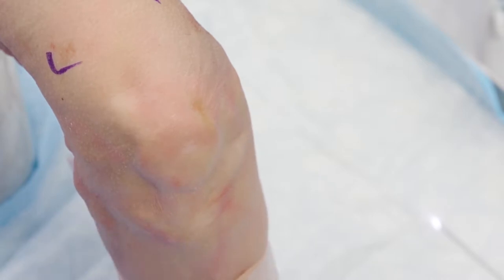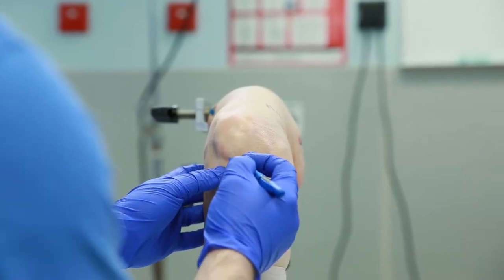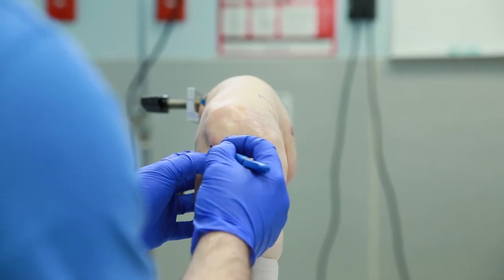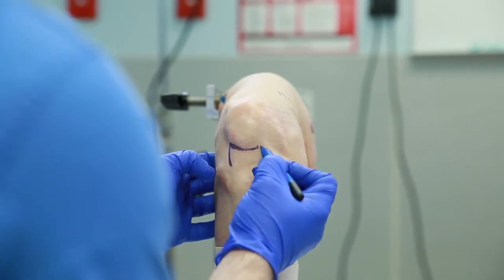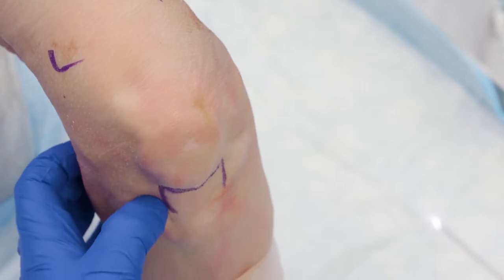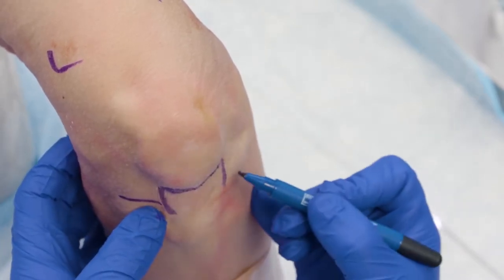When I'm setting the patient up, I'll go ahead and take a marking pen and mark out my bony landmarks. I'll mark out the inferior portion of my patella, which gives me a good sense of where we're at. Then I'll identify my patella tendon on either side and mark this out just like in real arthroscopy. That way I know where I'm at at all times. I can palpate my tibial plateau and mark out where my menisci might be.